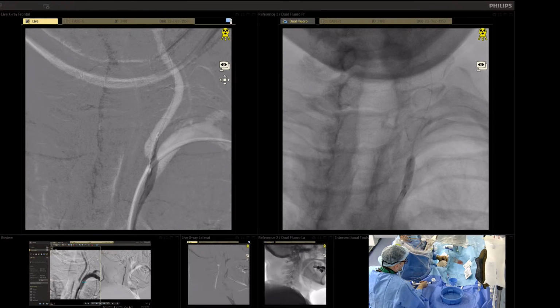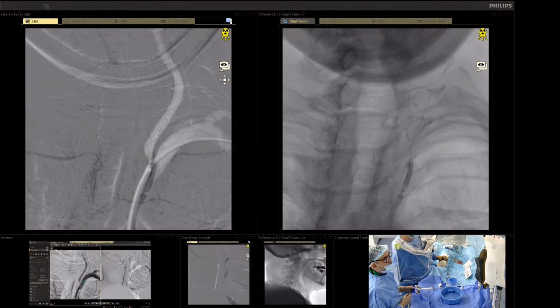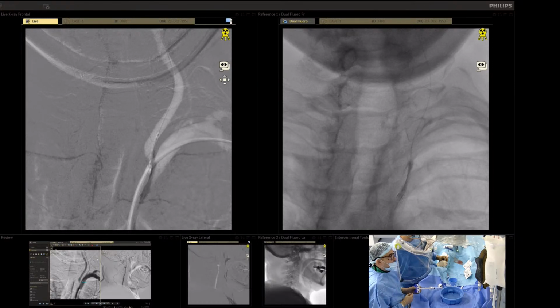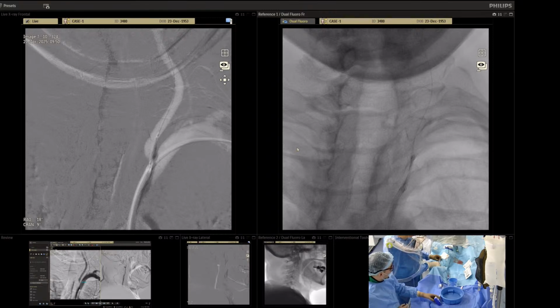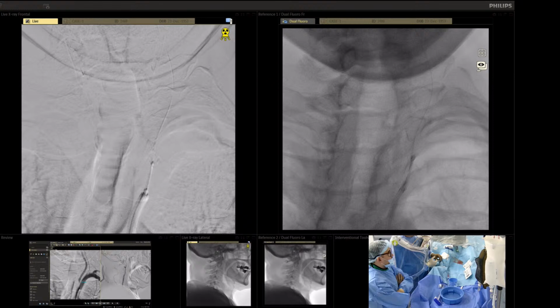Now we give 13 atmospheres. I have seen this technique from Adnan Siddiqui. It's to enlarge the entry zone a little bit, to have a difference between intra and extra.